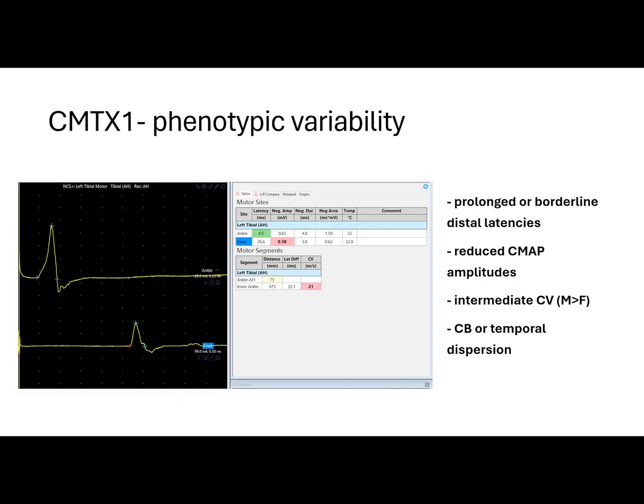Now let's look at another less common phenotype, which usually presents with significant variability between women and men. CMTX1 can present with asymmetric motor deficits, non-uniform reduction in conduction velocities, conduction blocks, and velocities in the intermediate range — findings that can be misinterpreted as an acquired neuropathy. In this example, we can see a left motor nerve conduction study with borderline to prolonged distal latencies, reduced motor amplitudes at 0.8, reduced conduction velocities at 21 meters per second, and a partial motor conduction block — although we have to be very cautious when interpreting conduction block in the tibial nerve, especially in the presence of small distal amplitudes.